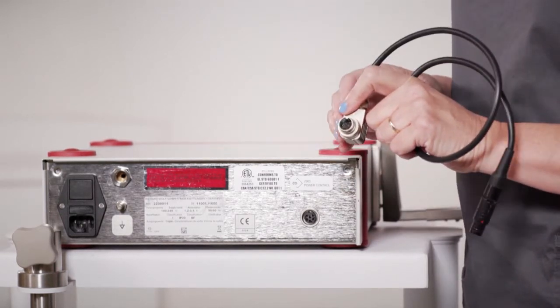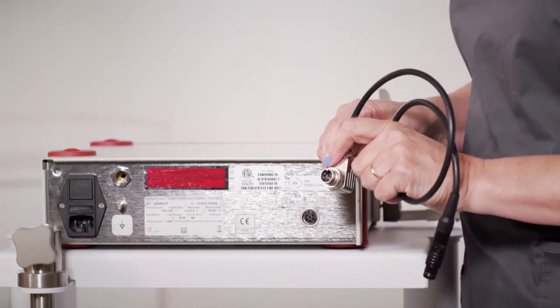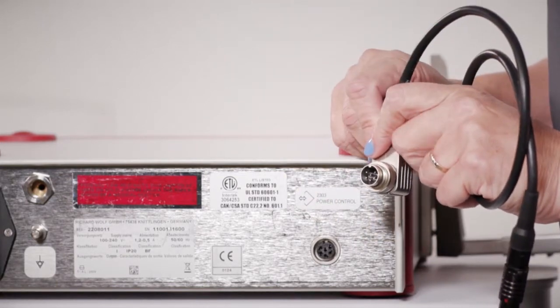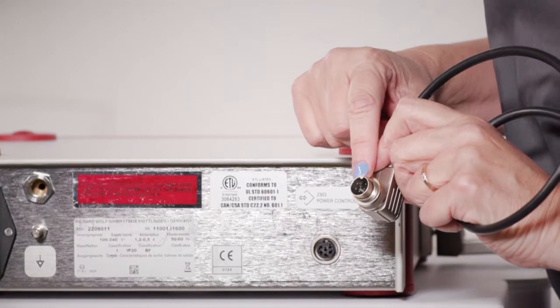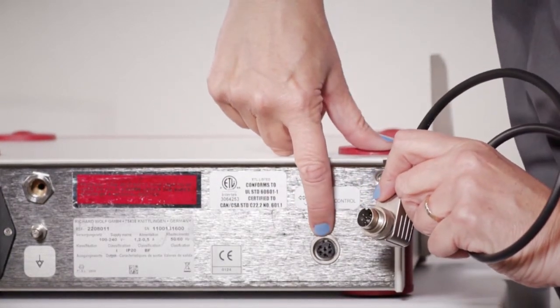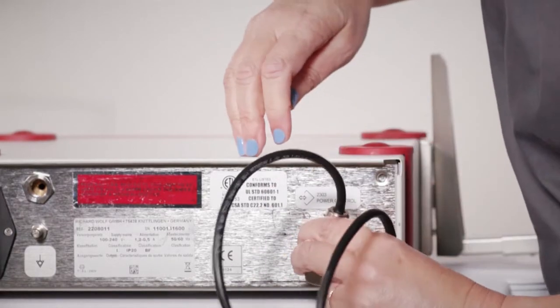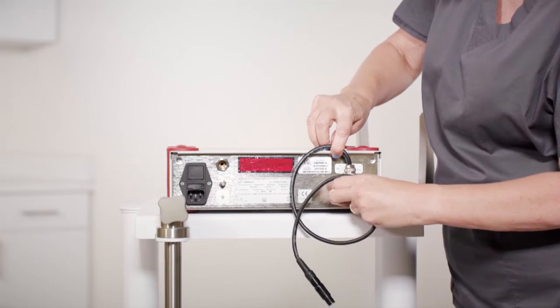The connection cable has a metal end and a black end. The metal end will attach to the suction pump unit. The connection cable has a notch at 12 o'clock and the suction pump unit also has a groove at 12 o'clock. Align the notch and groove, pushing straight in and turning the outer ring clockwise to secure in place.